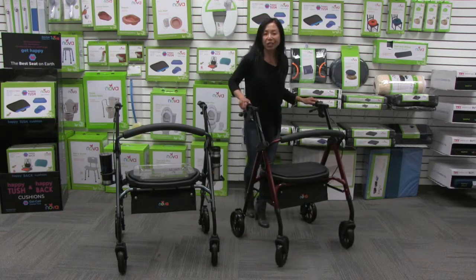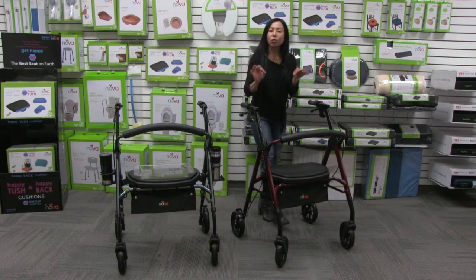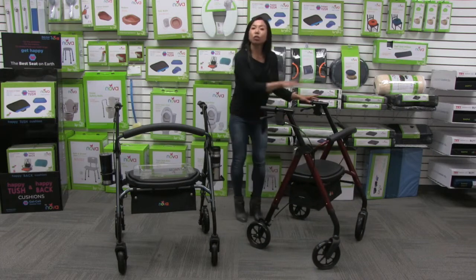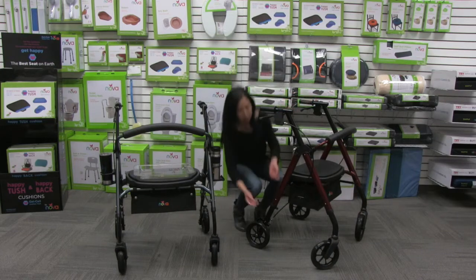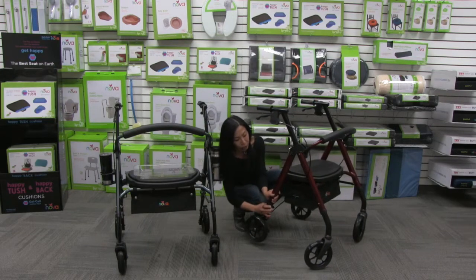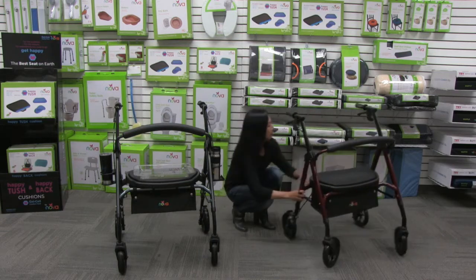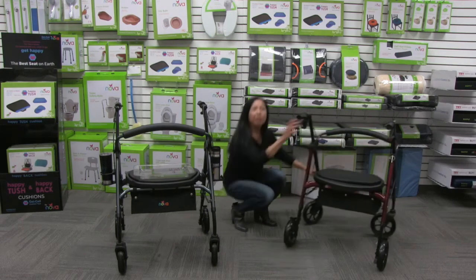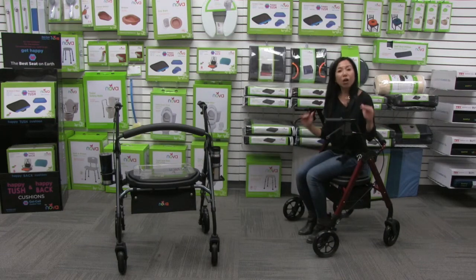It comes with a perfect fit adjust system that lets you customize this to your height so you'll feel really comfortable. Right now the seat and handles are too tall for me, so I'm going to lower the seat two inches. Just push this button and lower each of the legs two notches — that was so easy. Now when I put the brakes on and sit down, my feet are flat on the ground, which is a very comfortable and safe seating position.